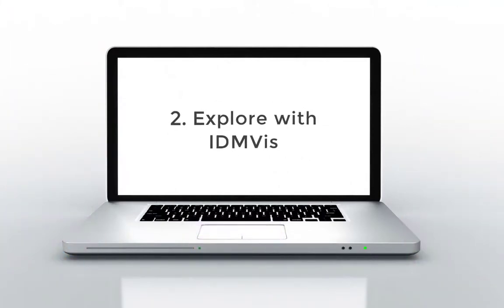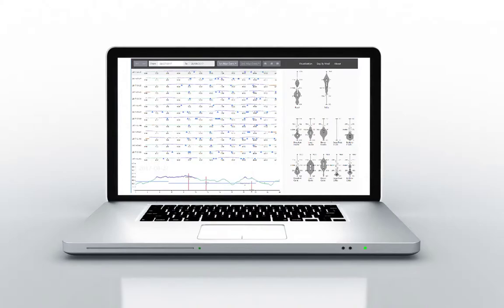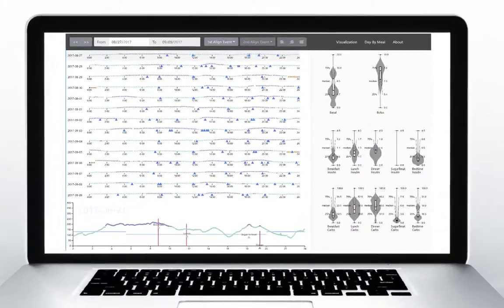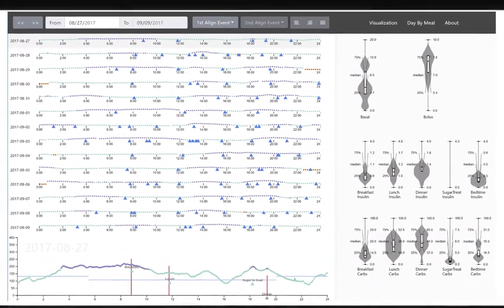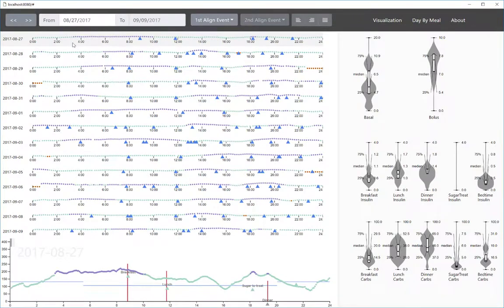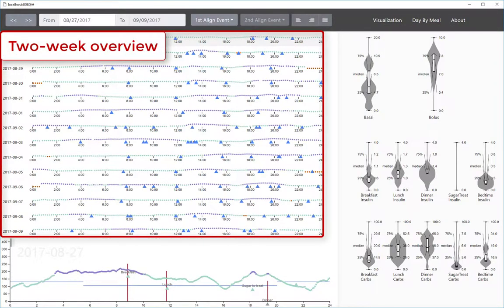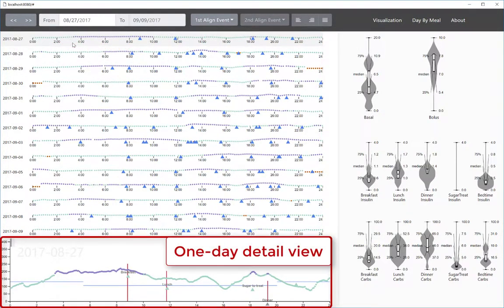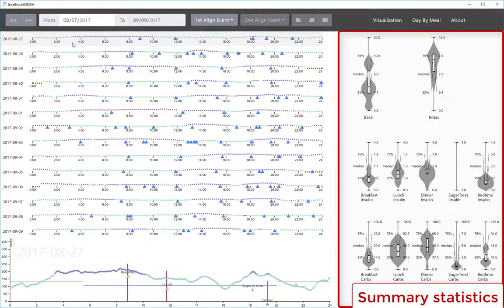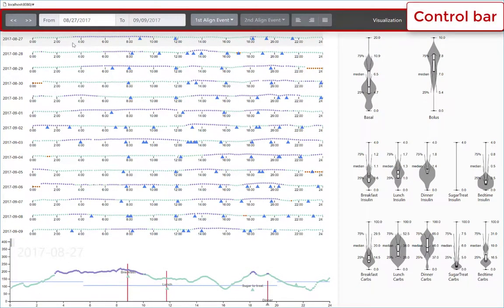Step 2, explore this data with IDMVIZ. The IDMVIZ interface shows the patient's data for the last two weeks. It consists of a two-week overview, a detailed view for individual days, a summary statistics panel, and a control bar.